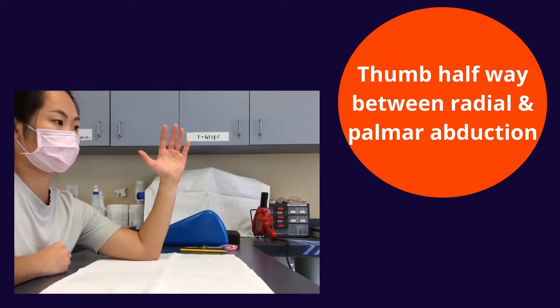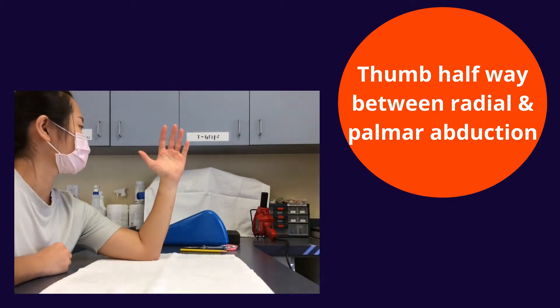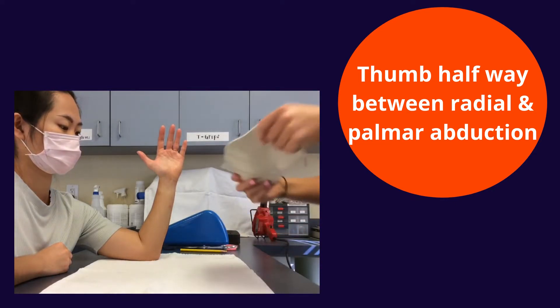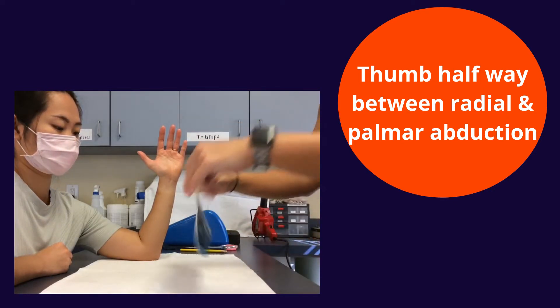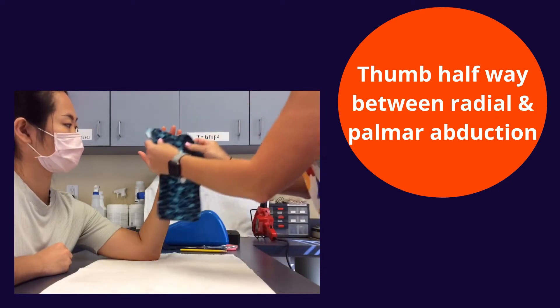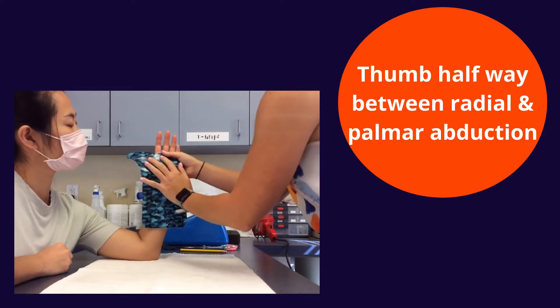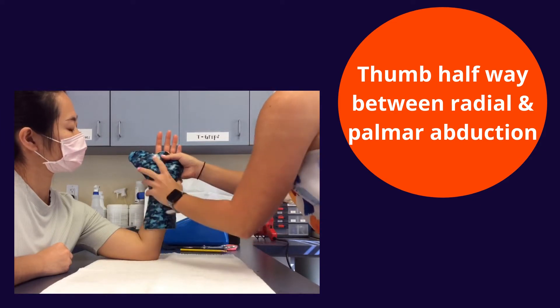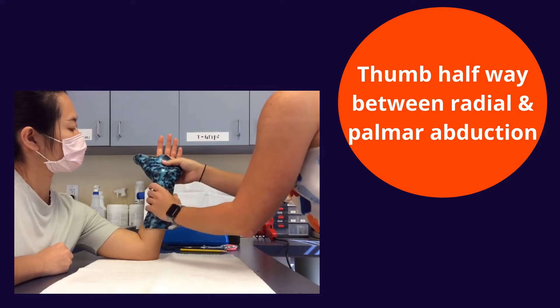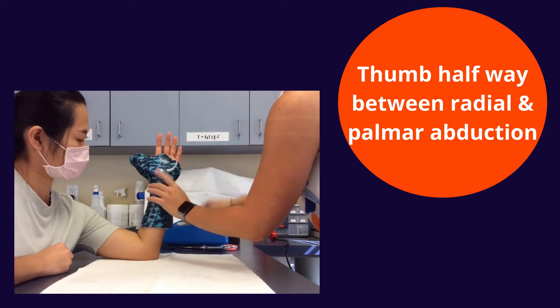Next, make sure your patient is in the proper position, including the thumb, before starting to fabricate. As you begin to make your adjustments, make sure the DPC is cleared to allow for digit active range of motion, and make sure the orthosis does not come up too high on both sides of the forearm or the patient will slip in and out of the orthosis. Use your pencil to help mark off where you would like to make these adjustments.